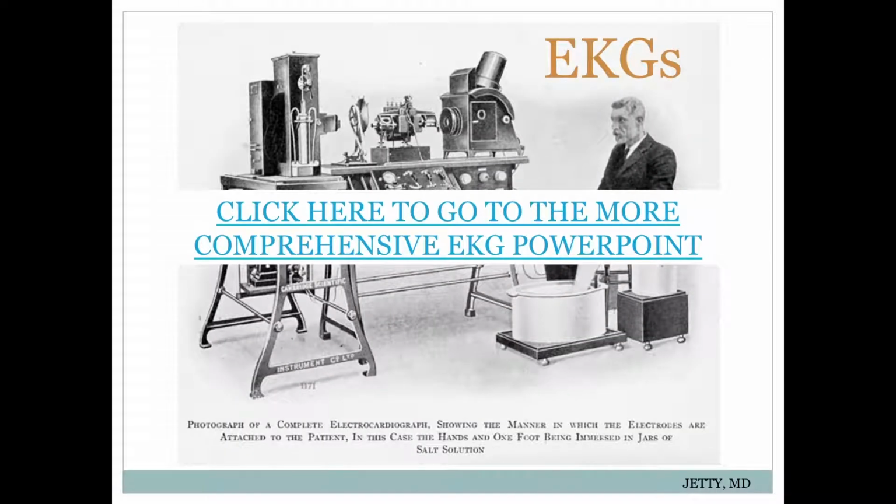So I'm not going to go through everything. EKGs can be pretty nuanced and complicated. And if you want a short little refresher on the basics, you can click on this link and you'll be able to find what I've created previously.